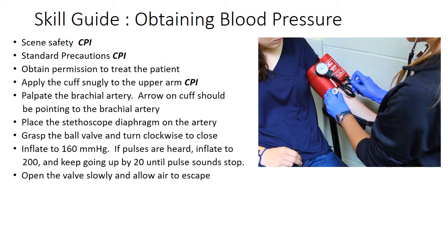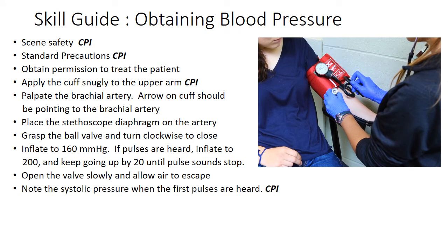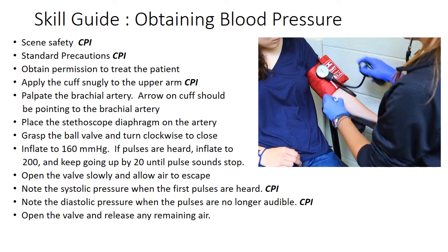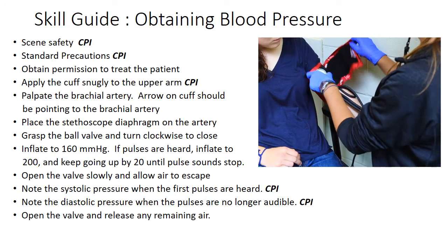Open the valve slowly and allow air to escape. Note the systolic pressure when the first pulses are heard. Note the diastolic pressure when pulses are no longer audible. Open the valve fully and release any remaining air.